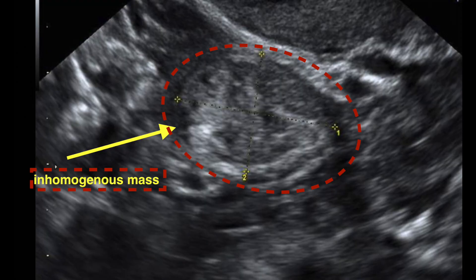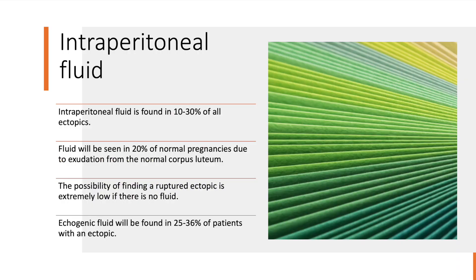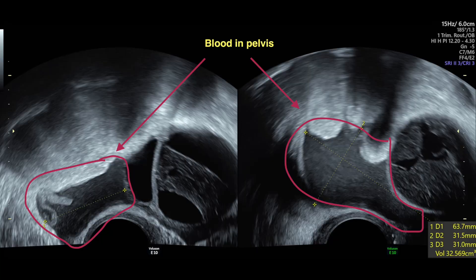The next sign is the presence of intraperitoneal fluid, which is found in 10-30% of all ectopic pregnancies. Echogenic fluid is found in 25-36% of patients with ectopic pregnancy, as shown in this picture, which is suggestive of blood and fluid.